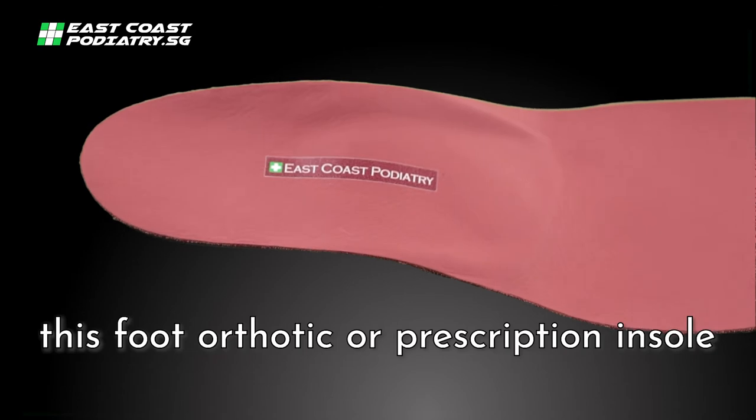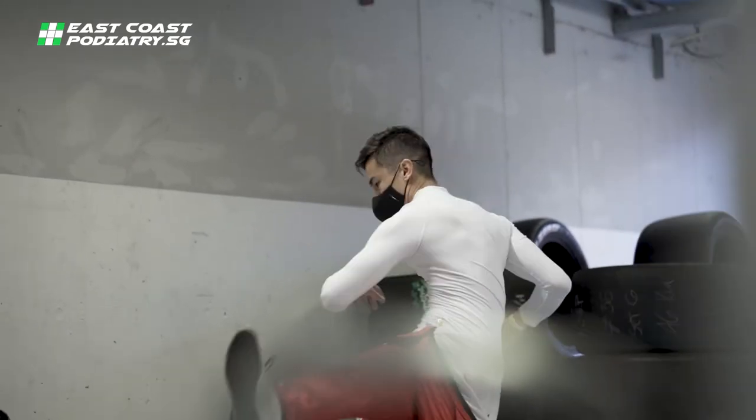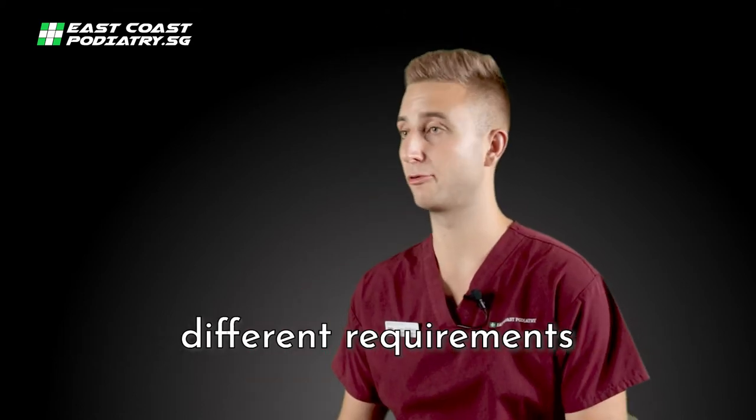This foot orthotic or prescription insole is specifically made for Sean's race shoes. For his trainers or running shoes, we would use a completely different material and design concept, as this would have to meet a different requirement.